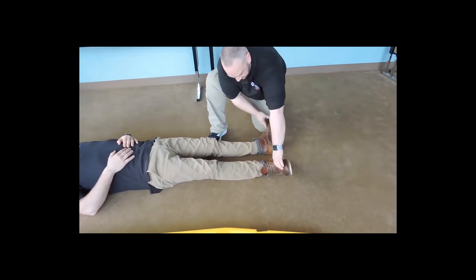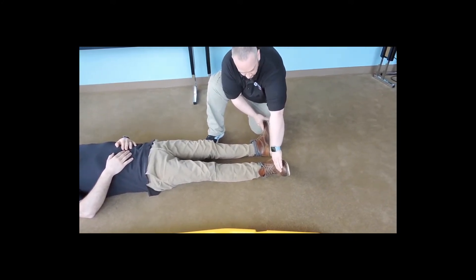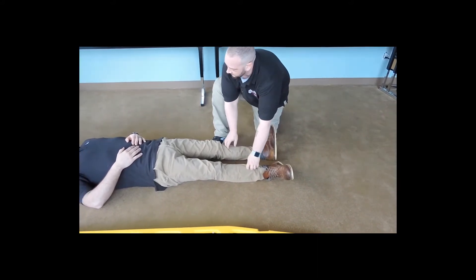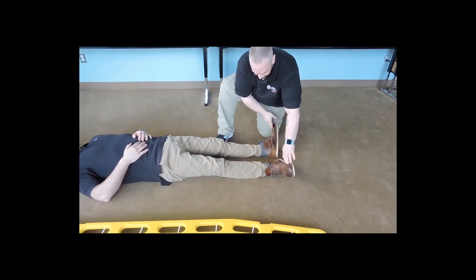Moving down to the feet. I'm going to check — shoes will be removed. We're going to check for pedal pulses, making sure they're present and equal. Can you feel me touching you? And the same on both sides? Can you wiggle your toes for me?